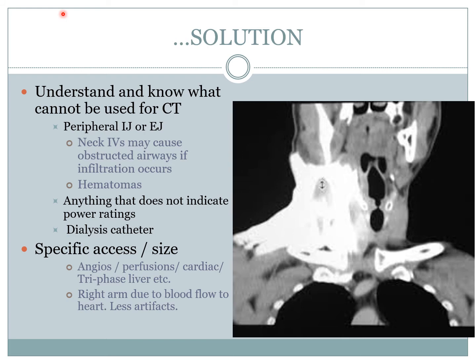And this is because of the left arm, when it goes through. So this is the right side, this is the left side. It's opposite in X-ray and CT. So when you're in the left arm, the vein here, when the contrast is coming in from the IV, the contrast will come in and then it has to cross over and come back around. So that causes artifacts there.